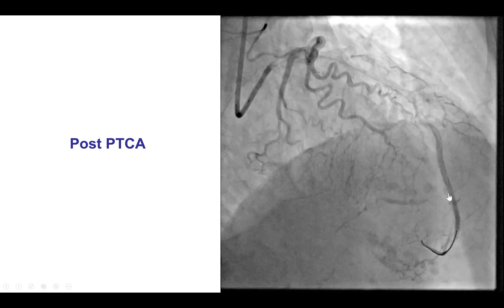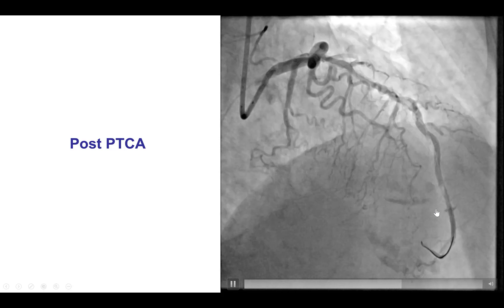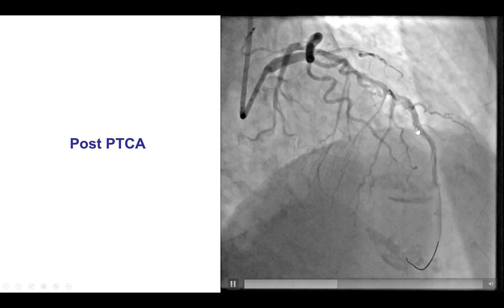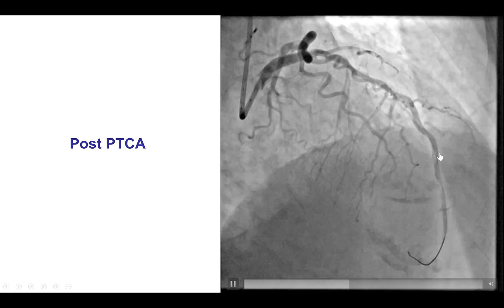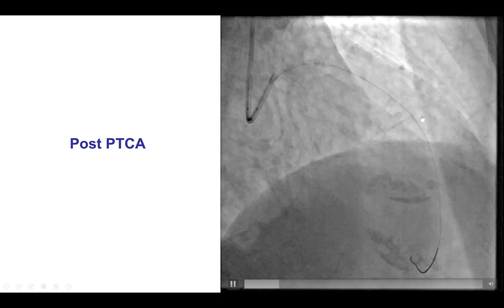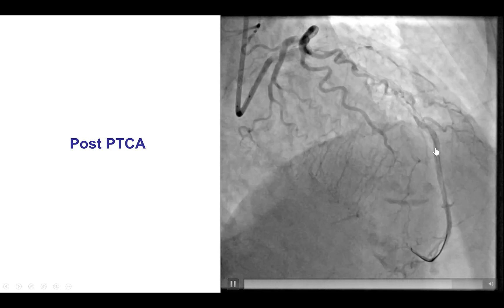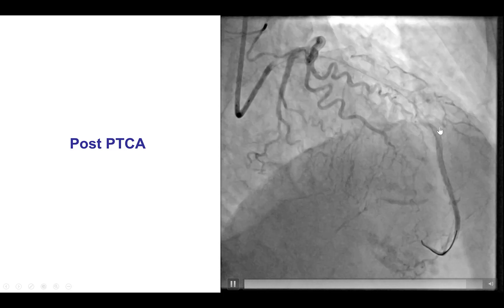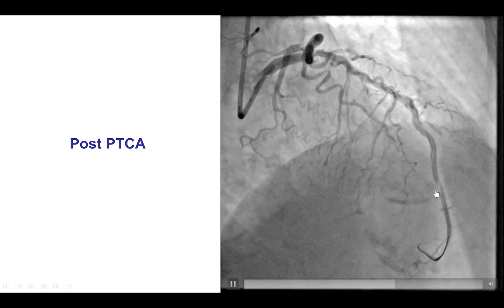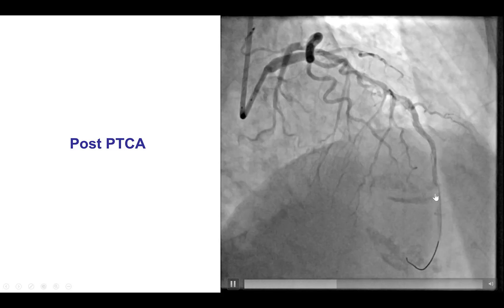We decided to perform balloon angioplasty, which restored TIMI 3 flow to the distal LAD. The question now is whether we should place stents, knowing we have an extensive area of dissection in the mid-LAD, or whether we should let the patient recover, allow the dissection planes to heal, and bring the patient back later. The downside of leaving the dissection is that there is a large filling defect and a significant risk of acute vessel closure, which could be a major event given the large size of the LAD.